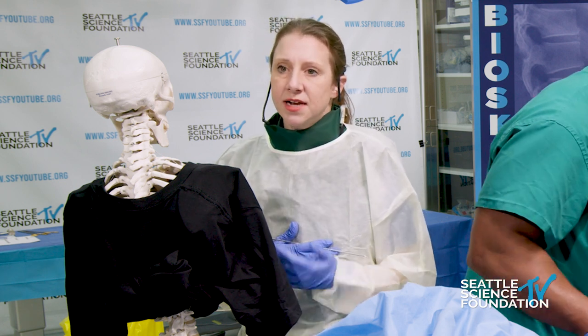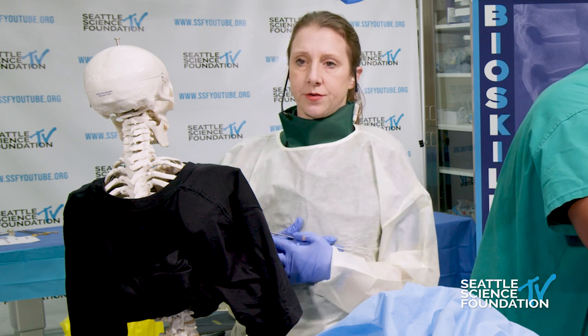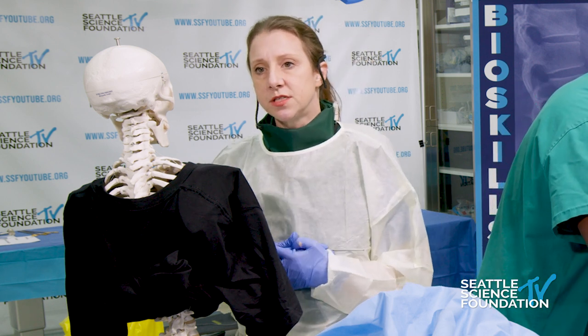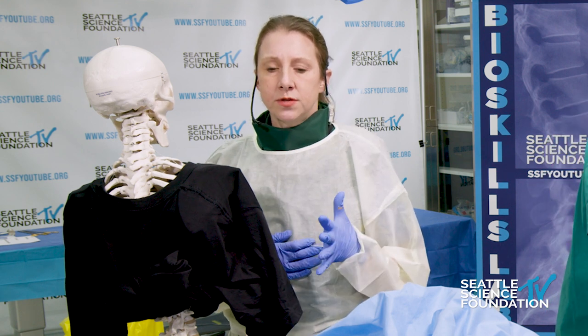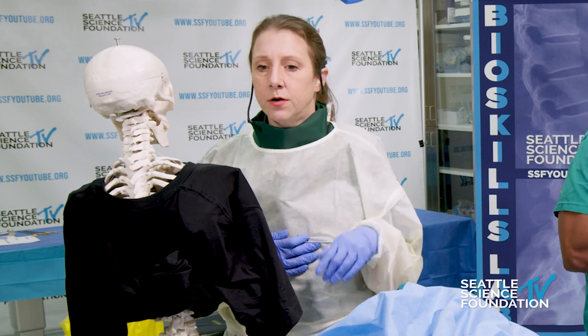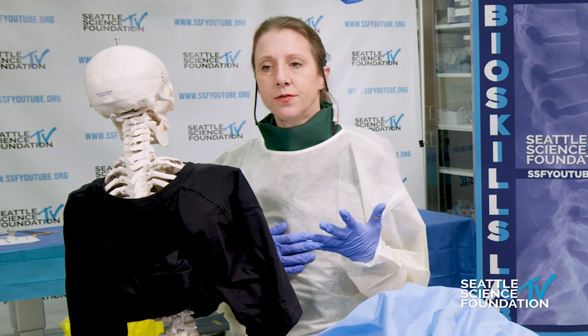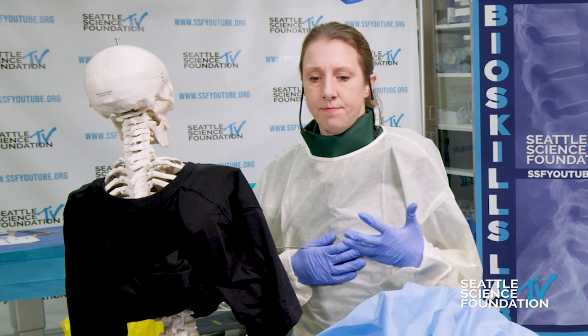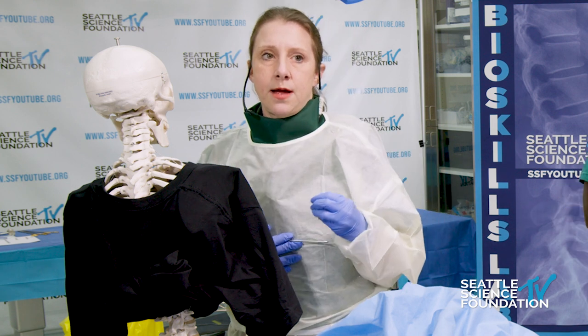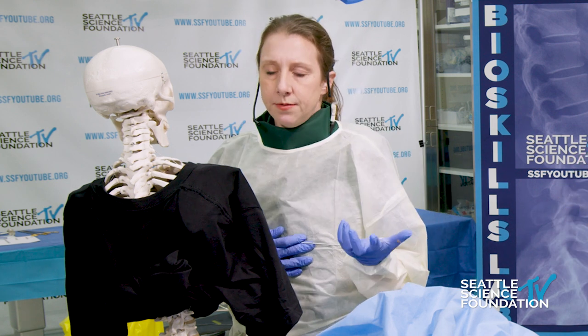We've had other generators as well in my practice, but one of the advantages of this generator over others is that there are times when you are beginning or in the middle of a radiofrequency lesion, and it indicates that there is resistance and the lesion is aborted.